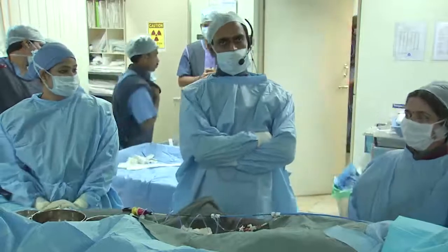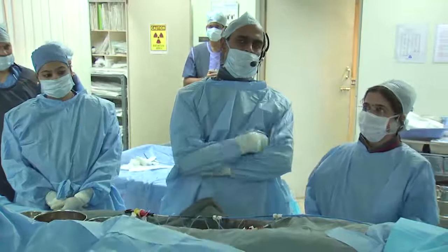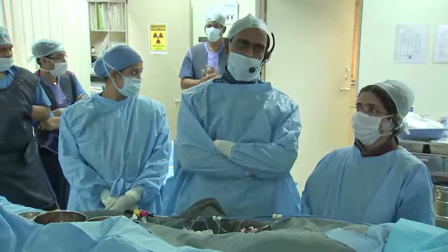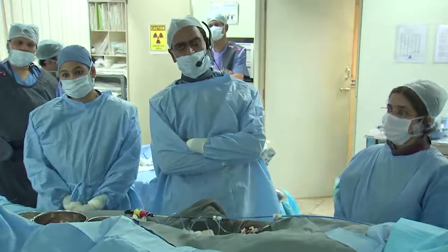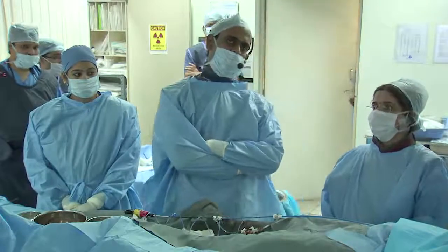As Dr. Locke was pointing out, there is going to be some degree of fibrin deposition and maybe endothelialization from the left atrial side of the device. And I think the device may get a little smaller than 4, which might perpetuate a small thrombus formation within the device, and it may close off. So 4 was a little smaller for me.